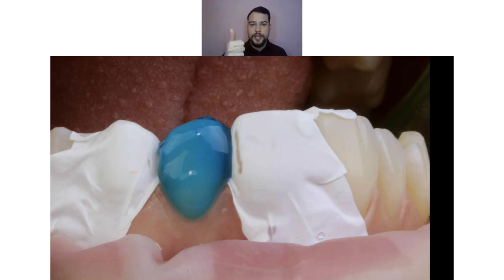Now, you can prepare your enamel in three ways. By prolonged etching time, this is what I do mainly these days, to etch for 60 seconds. Or you can do sandblasting with 30 or 50 micron aluminum oxide on high pressure, to remove the surface layer of the enamel, to do the micro preparation. This is also an option. Or you can use some rough disc to roughen the surface.